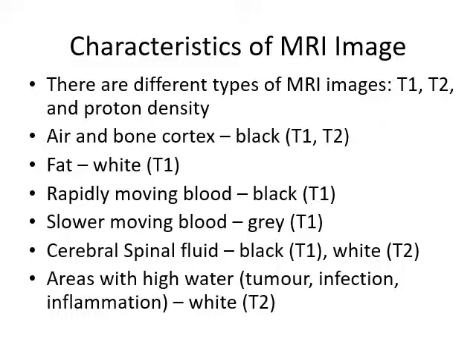This T1, T2 just means the different way they change the densities on the MRI machine. So I won't ask you, what color is such and such in a T1 or a T2. You don't need to know that. It's just interesting to know.